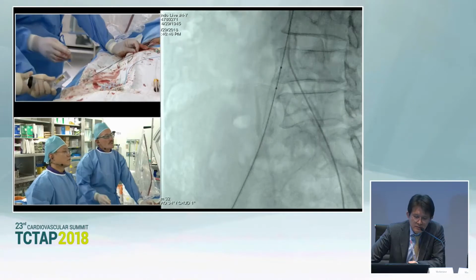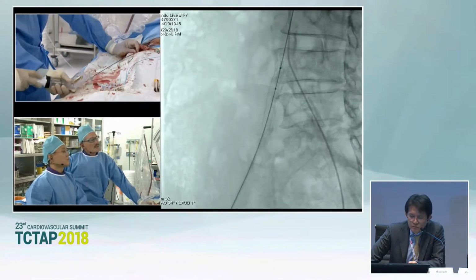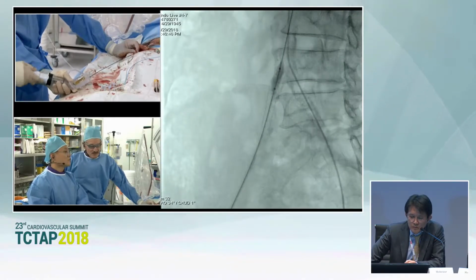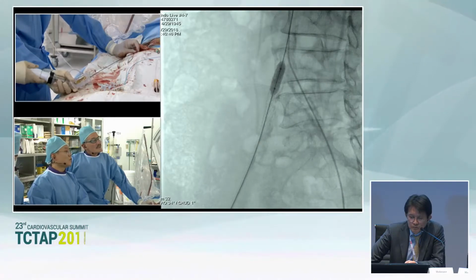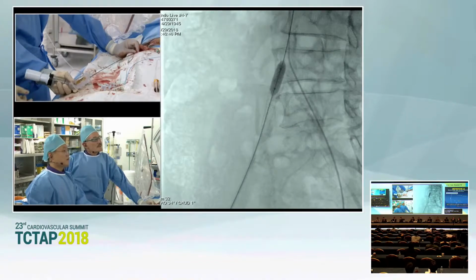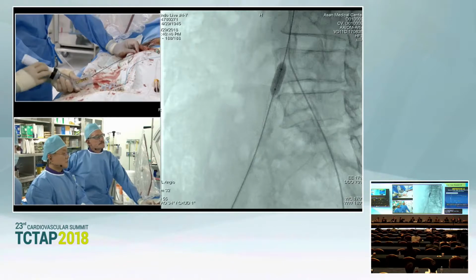Stent graft, you want it appropriately sized, not oversized. Here, and now you can go bigger. This common iliac is bigger. What's the rated pressure on the balloon? Luminary 8. That's good there. Any pain? No pain. But the common femoral is 7 millimeters, a bit too small.